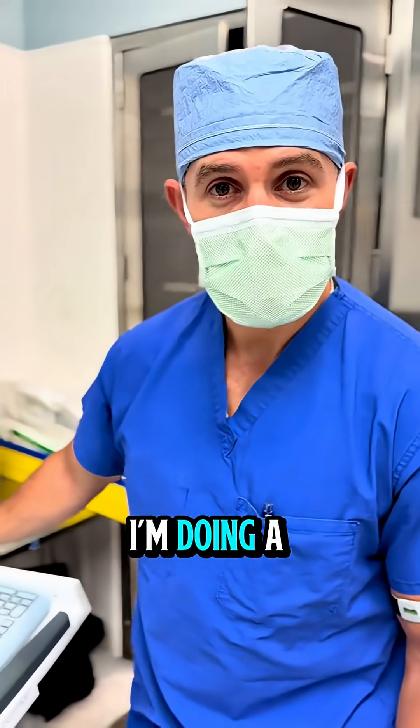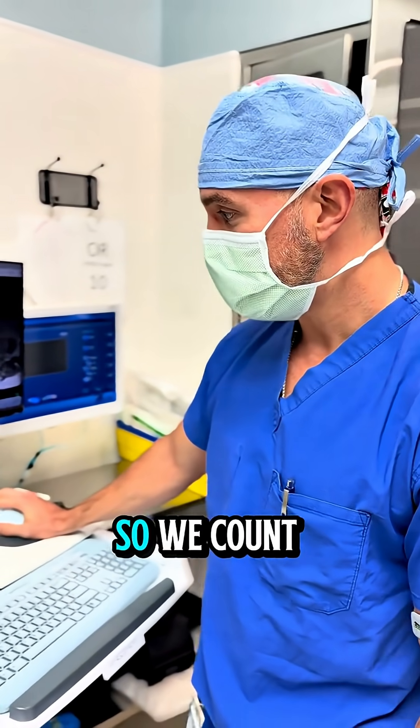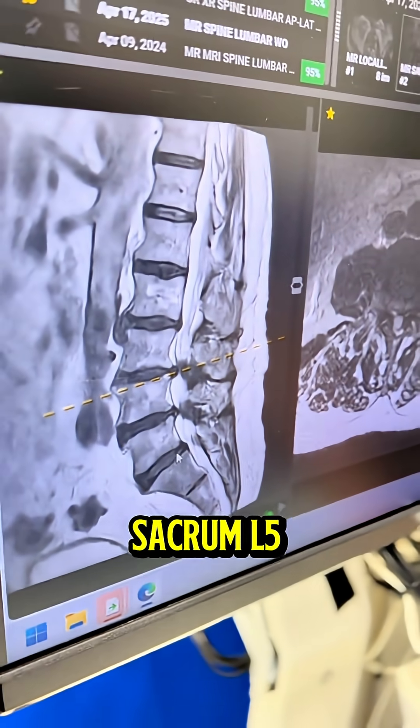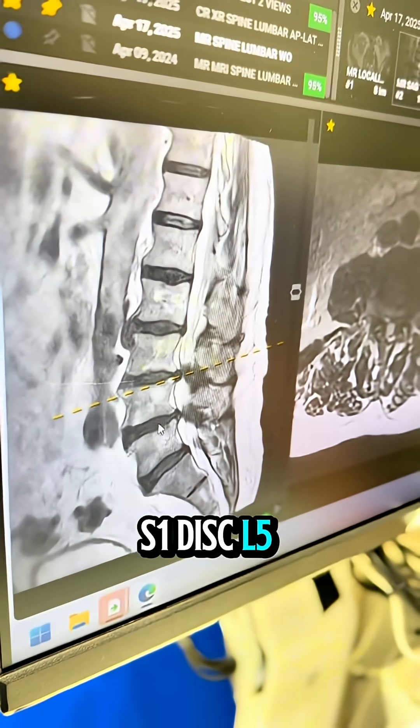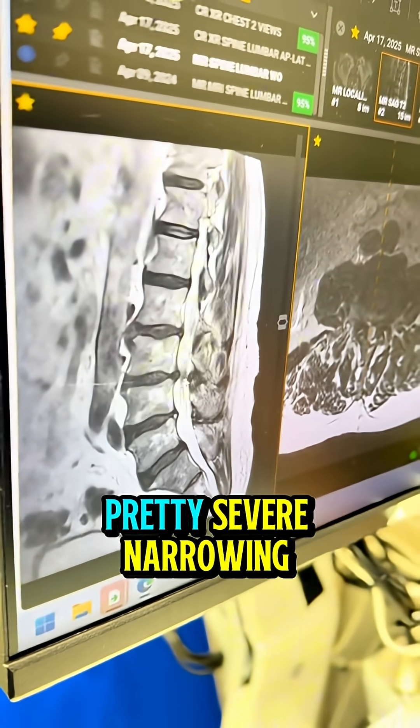Last case of the day — I'm doing a minimally invasive laminectomy at L3-4. We count from the bottom up: this is the sacrum, L5, S1 disc, L5, L4, L3. You can see here that there's pretty severe narrowing.